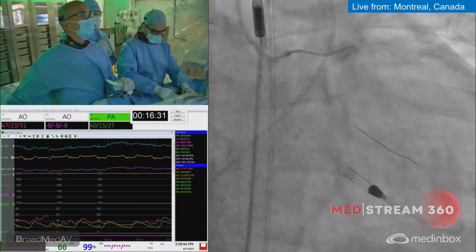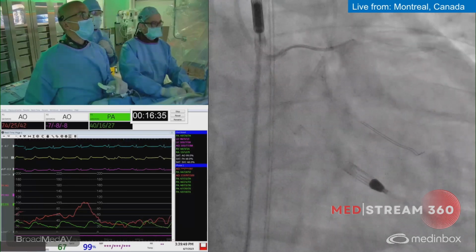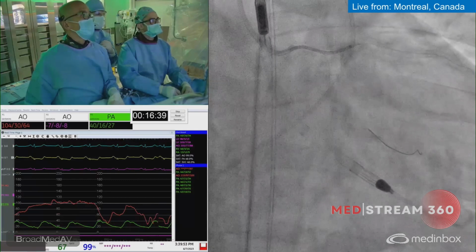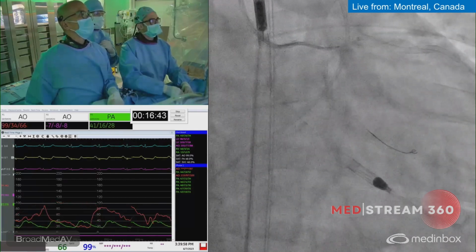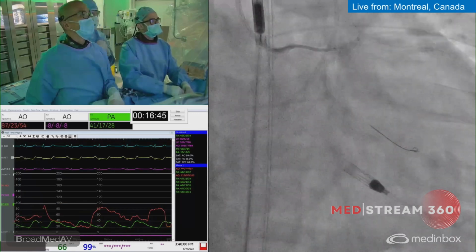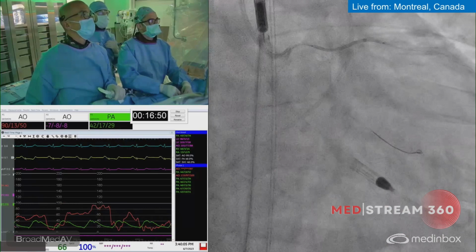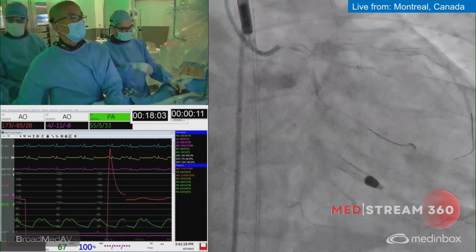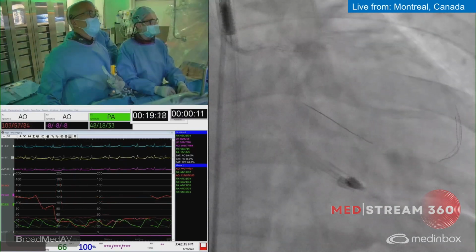That's good. All right, it's not going. Yes, it's at the stent. Yeah, so it's curved. Push it. Let me try to get the GuideLiner. You got it through. Yeah, GuideLiner is inside. There you go. All right. Perfect. Oh, beautiful, everyone. We'll see the flow. If TIMI 3 is there, I'll go gentle.